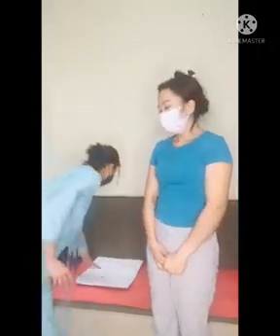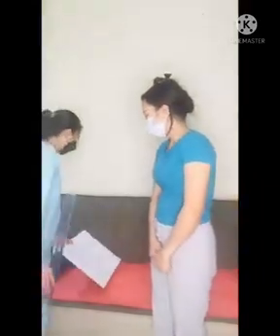So, projection 17 that we're going to do is the SC joint PA oblique projection, body rotation method, RAO or LAO. We're going to use the 10x12 image receptor. The patient is in prone position.